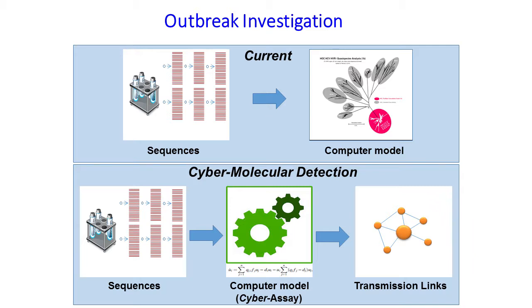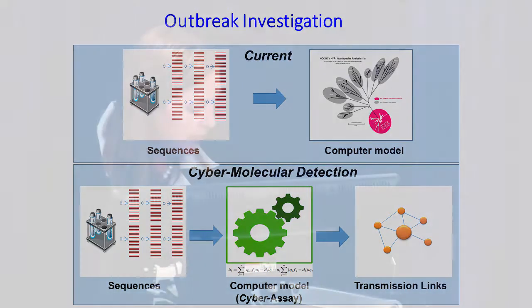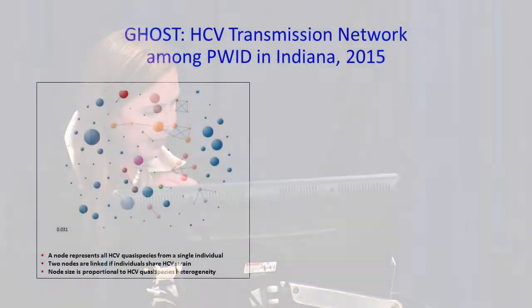We have now transformed this approach into a novel technology called GHOST, for Global Hepatitis Outbreak Surveillance Tool, where laboratories who have the capacity for next-generation sequencing and use CDC-developed protocols can generate the next-generation sequences, upload the sequences into a web-based program, and automatically receive results in this graphic format showing whether or not any transmission links existed among the tested patients.